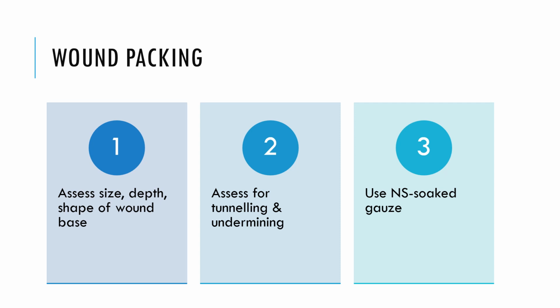And use saline-soaked gauze. That's the most commonly used dressing you will see in the clinical area. The gauze is available in different lengths and widths, so you have to use nursing judgment to select the size of the gauze based on the size of the wound.